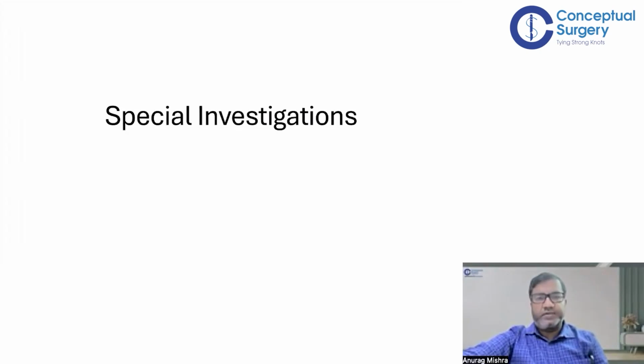Hi friends, so we are back with another video on radiology for surgeons, and in this video we will talk about some special investigations. We have talked about the basic principles of radiology. We've talked about how to safely use X-rays and radiations. Then we talked about plain X-rays, then contrast X-rays, and in that same sequence, now we will be talking about some special investigations today.